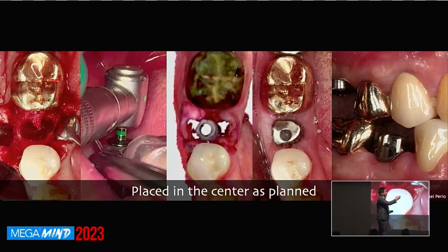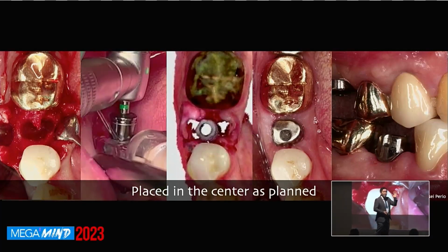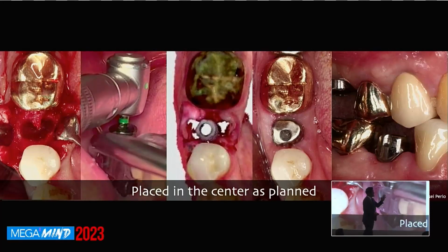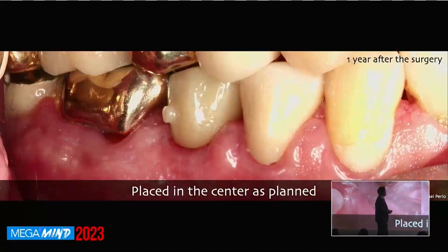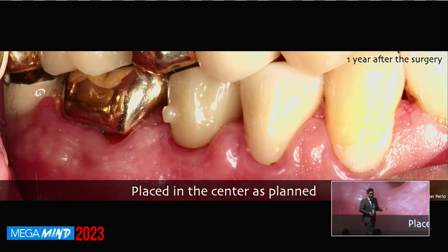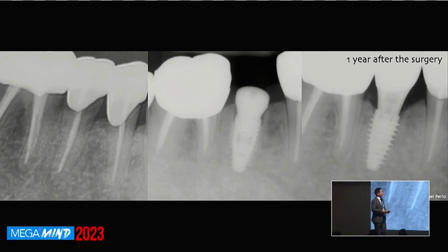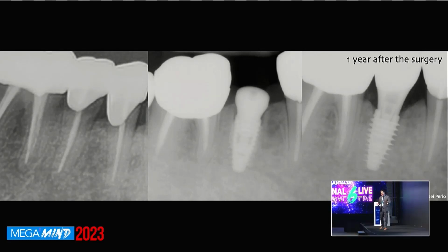And this time as well, the prefabricated, customized healing abutment was successfully delivered. After the soft tissue healing, we delivered the prosthesis, and this patient as well is being followed up right now. The serial X-ray tells us that this patient is using this implant so well without any complication. The bone level is kept fine.